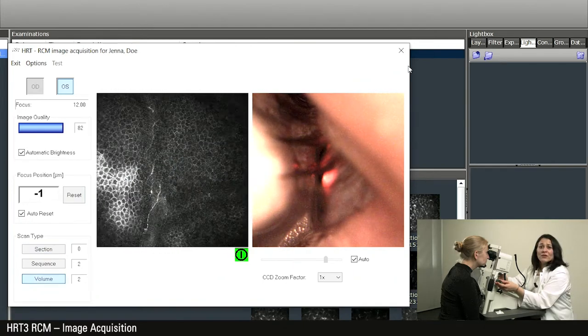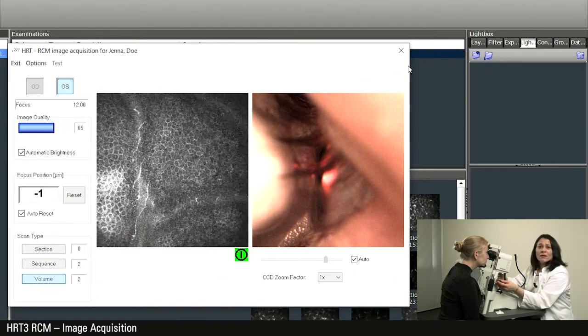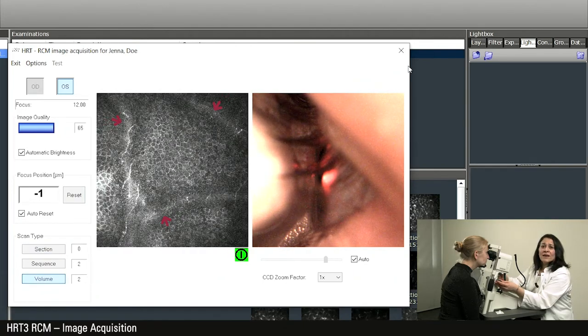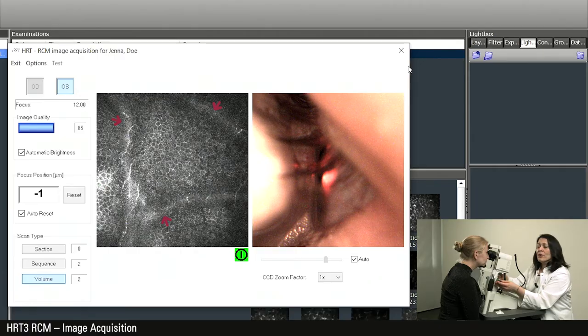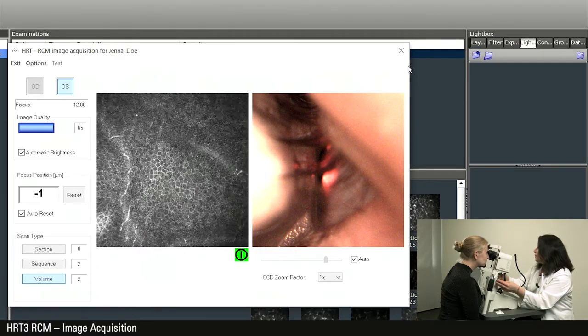If the pressure is too strong, wrinkles will appear. In this case, please move the HRT camera back slightly.